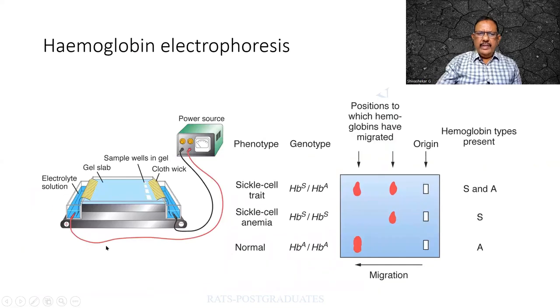So this is what we had seen earlier, and then there is hemoglobin electrophoresis. I showed you a train journey also. So you find that by this the different things can be separated. The hemoglobin S is being separated, we are able to identify. By that you find subtle things like sickle cell trait, normally it is not visible. The hemoglobin also will be near normal, and in the peripheral blood you might not be able to see many sickle cells. So these could be visualized by means of this. So electrophoresis will be mandatory for us to make a diagnosis of something like sickle cell anemia or a thalassemia.